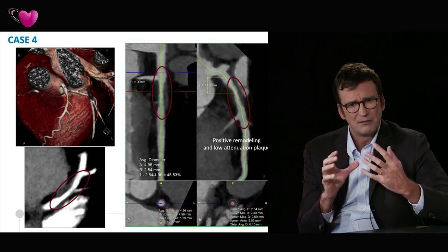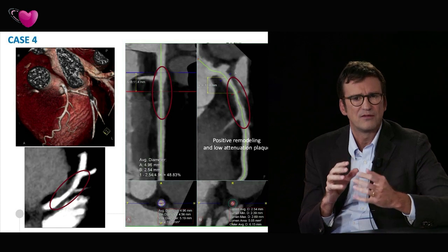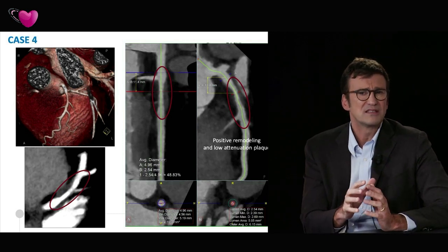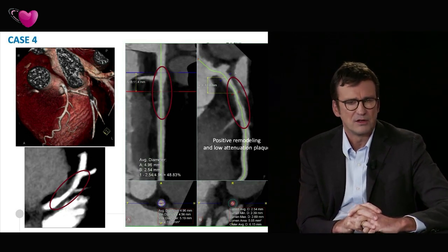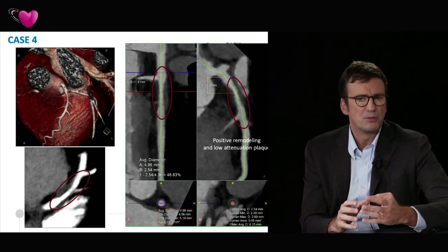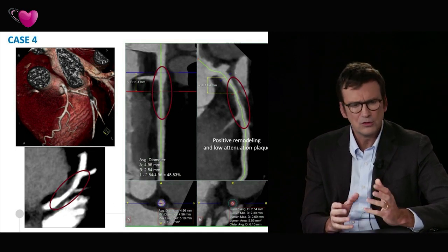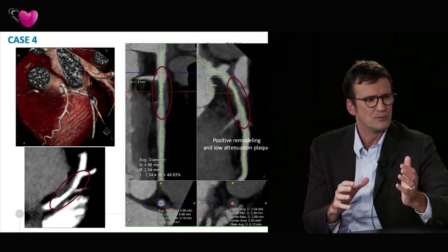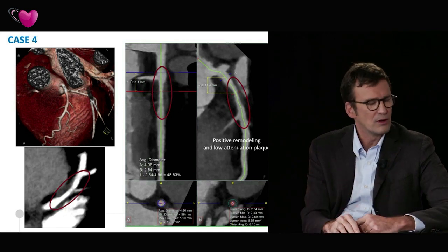But putting together wall motion and perfusion, which were normal, but also CFVR in the LAD, gave us the occasion to at least know what was the anatomic situation of the coronaries of this guy. And so putting together with contrast wall motion, perfusion, and coronary flow reserve using Doppler is very, very useful to have more variables. Then it becomes quite difficult how to manage the patient after the ischemia trial, but we know we will work on that.